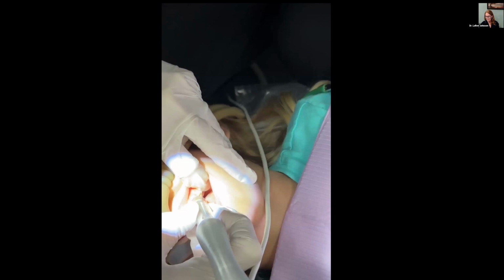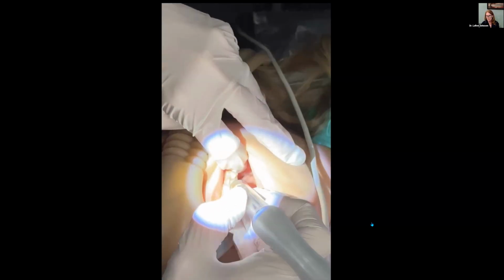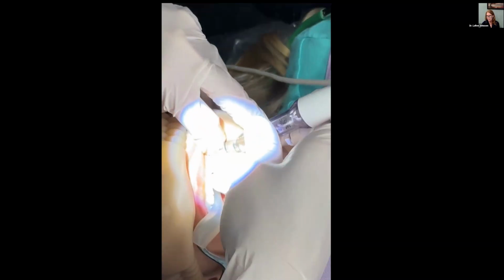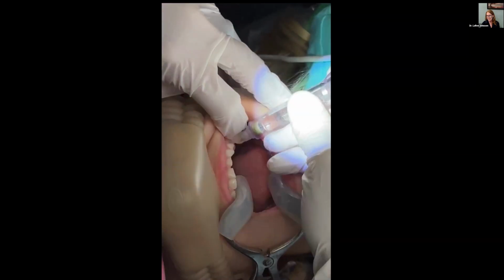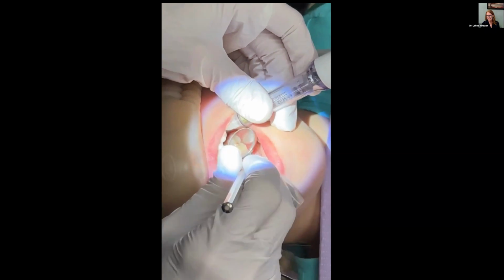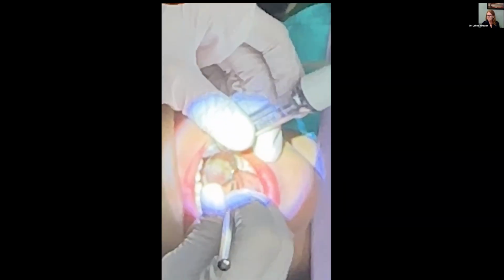So you want to talk about videos? Let's do videos. This is a really anxious little friend. This is the blanching step. You see the blue. You see my favorite dental high-tech device. This is popping through for her. And I know I try to look away with my loop light so that it doesn't bother people. You see me holding it with my left hand right now.